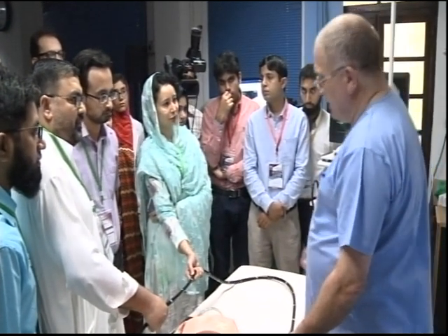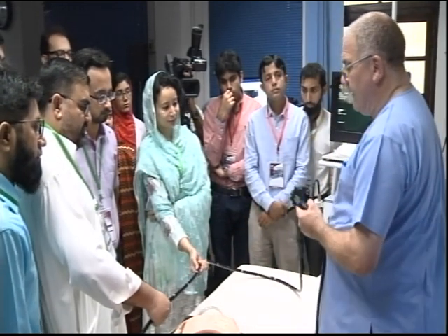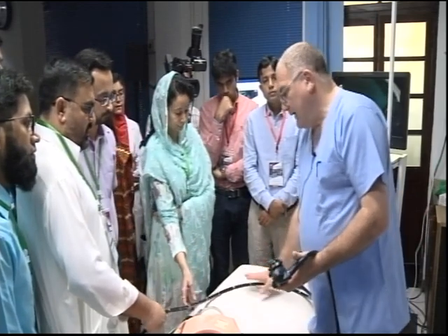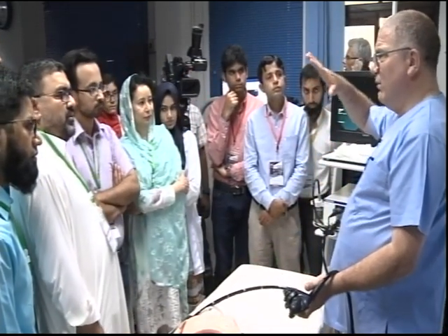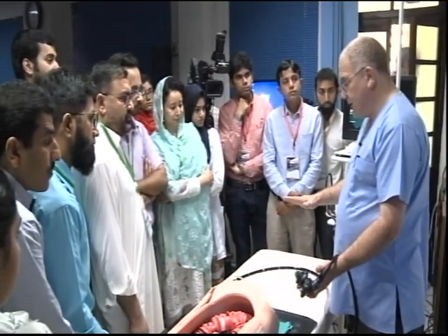Not relaxed. Not completely. Rigid. Your thumb is white. Yeah. I bring it here, it'll go pink. So a lot of people, what you've got is you've got a scope itself. Think of a snowshoe. A snowshoe covers a big space. And it forces into the bed.